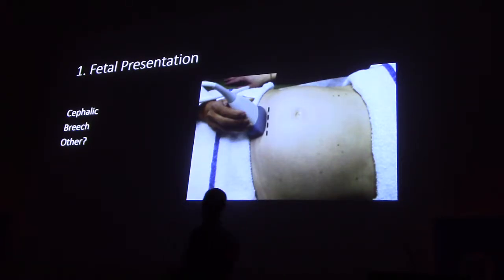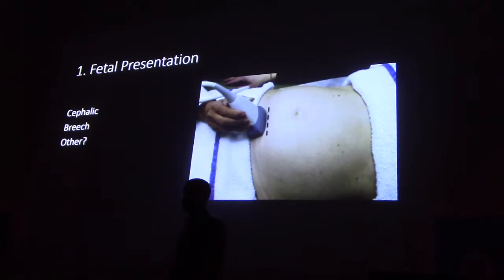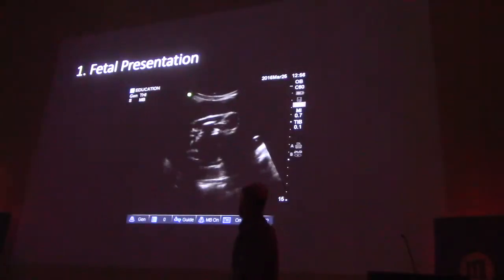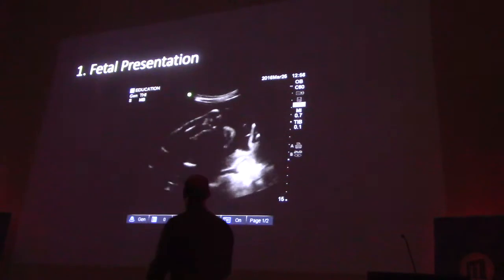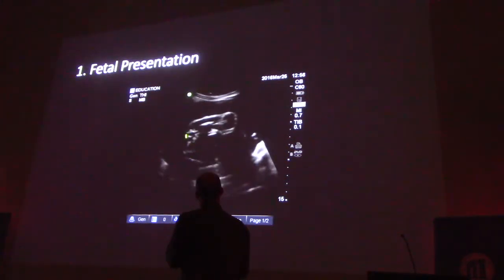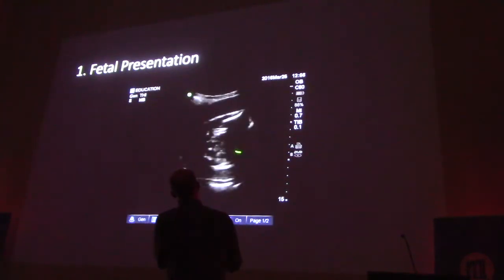I have a lot of difficulty finding things on a transverse view, and maybe it stems from getting a lot more information on the sagittal view from all my first trimester pregnancies that I've ultrasounded. So in general, I like to do it with a sagittal approach. You saw this image earlier. This is a sagittal approach again. You've got legs folded up here. There's an abdominal compartment here. And there's a hint of a head down there. Kind of got to trust me on this.